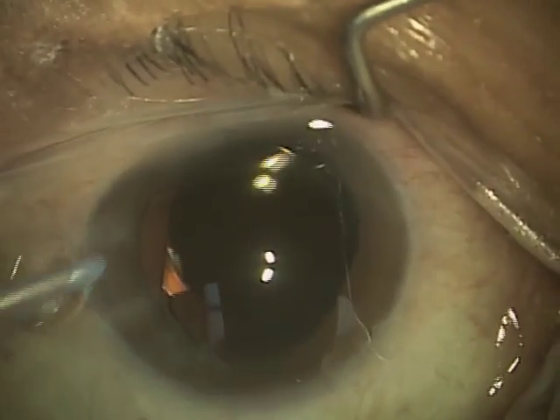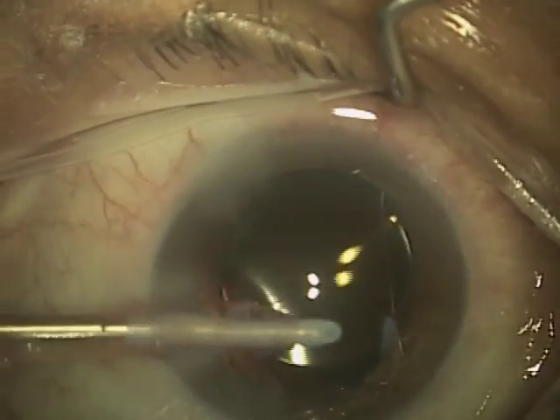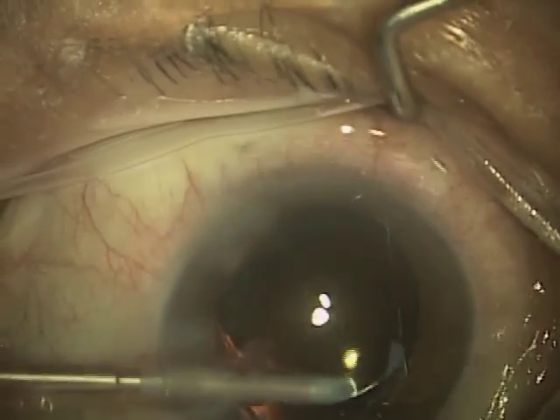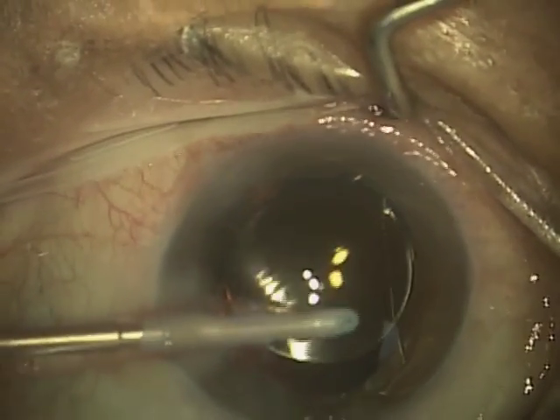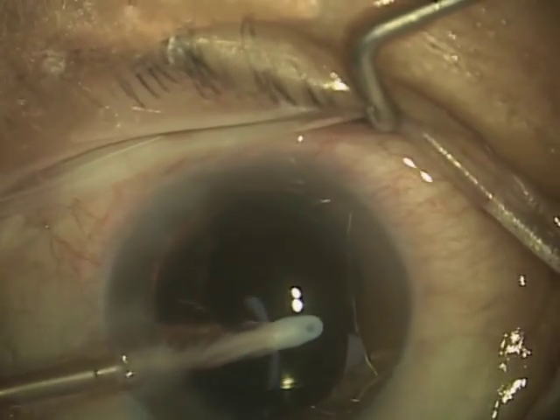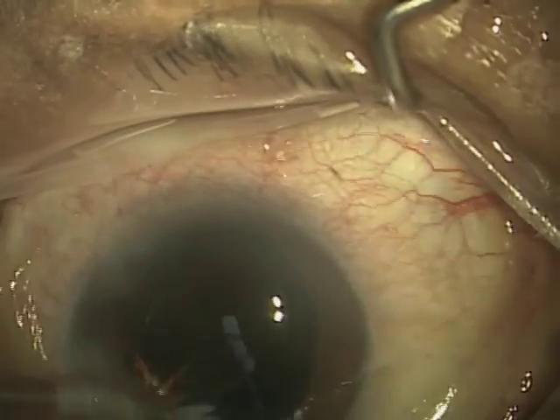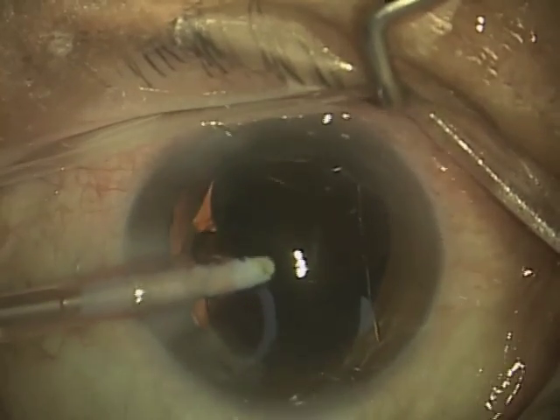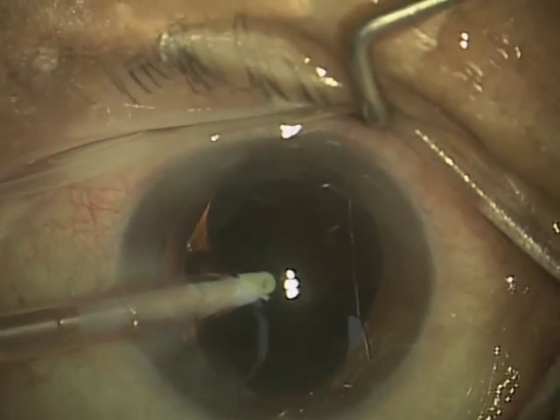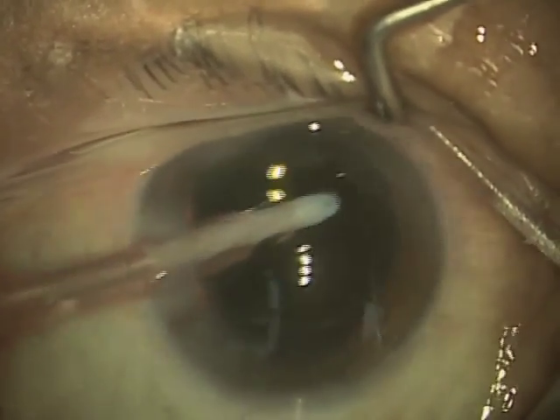Right now I'm in front of the lens. You see the patient moved a little bit — that's relatively common when somebody suddenly has clear vision because the lens is now in the eye. They want to look around, so I generally just gently inform them that we're almost done and just need them to keep looking straight ahead for a little bit.